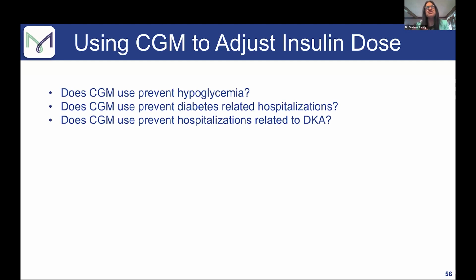So if you put the CGM on them that first time, and they see that and they're empowered by it, use it as an educational tool as well, I would say that over half of the patients are motivated to maintain it. But we all know that diabetes is also a progressive disease, so there may be things outside of their control. So I would say in my personal experience, about 50% of them do maintain that.